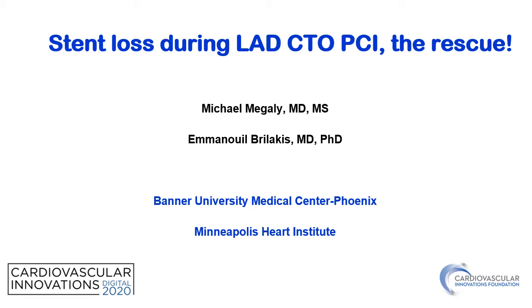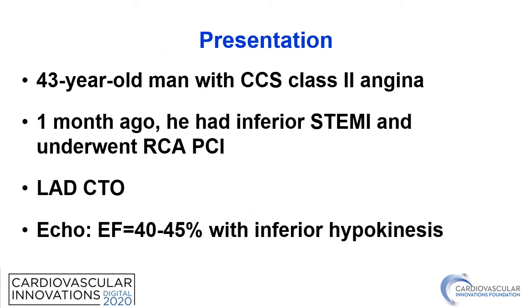I am presenting a case on stent loss during LAD CTO PCI and how we rescued it. Our patient is a 43-year-old man. He has class 2 angina. One month prior, he had an inferior STEMI and had RCA PCI, but he had a remaining LAD CTO. And given his symptoms, we decided to fix his LAD CTO.